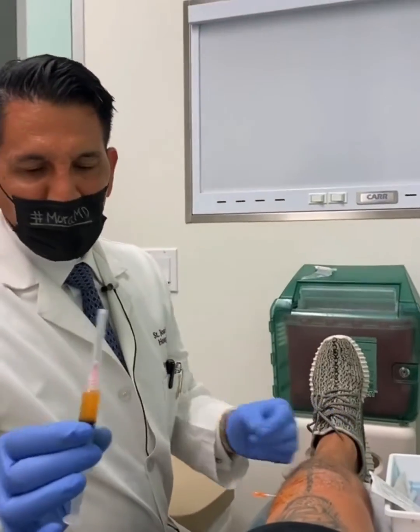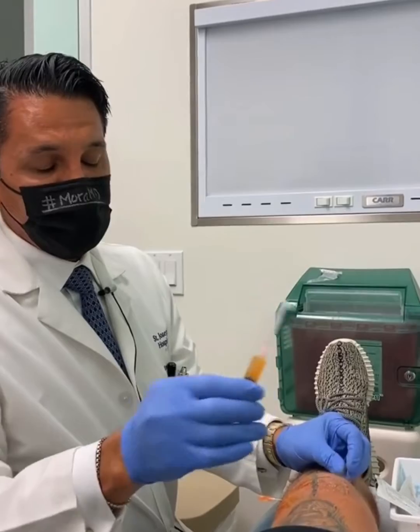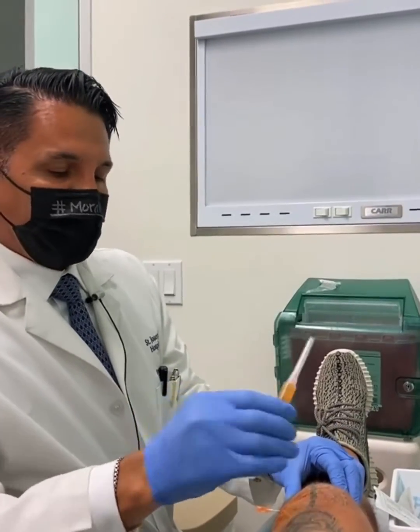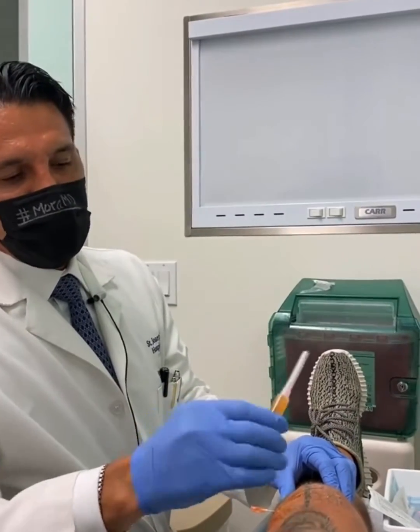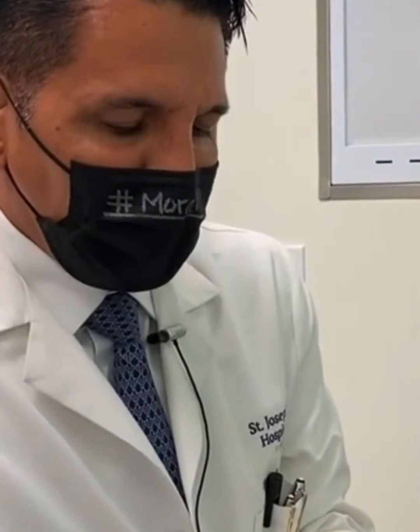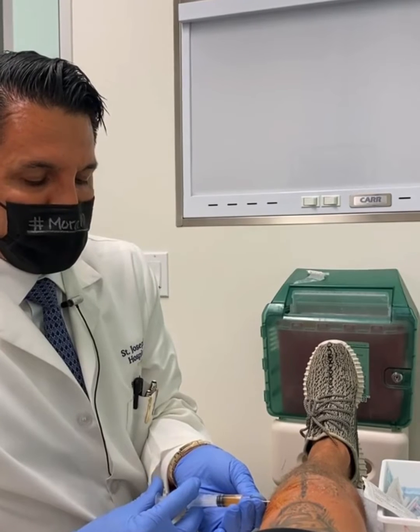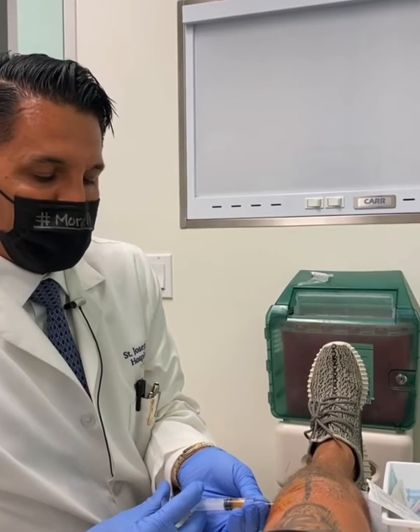High concentration platelet-rich plasma, double spun. That means that we removed the RBCs first, got rid of that column, then spun it again, suspended the platelets — three cc's of plasma — and we procure it in a way to maximize the monocytes rather than the granulocytes, so that it's not inflammatory. This is what's called leukocyte poor.